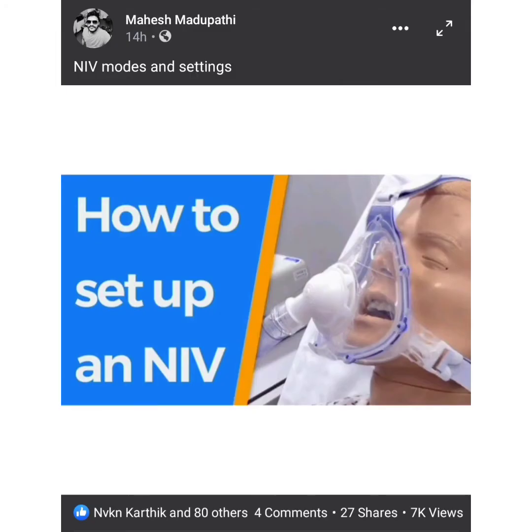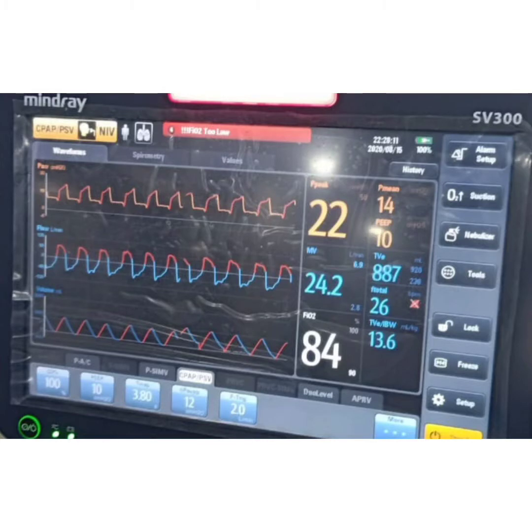In my previous video, I explained clearly about modes and settings of NIV. In this present video, I want to explain about wave patterns of NIV. To understand this video clearly, kindly watch my previous video. Here we can see a patient is on NIV, CPAP by PSV mode.